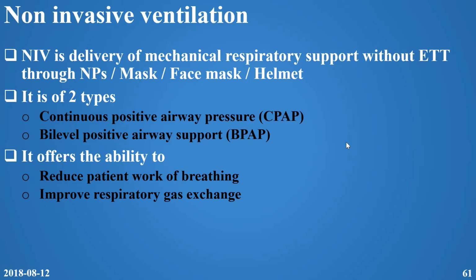So non-invasive ventilation is usually of two types. There is CPAP, or continuous positive airway pressure. When we say continuous, it means it gives you the same pressure during inhalation and exhalation. When we say positive, it means above atmospheric pressure. When we say airway, we mean the airway above the thoracic inlet, from the nose to the thoracic inlet.